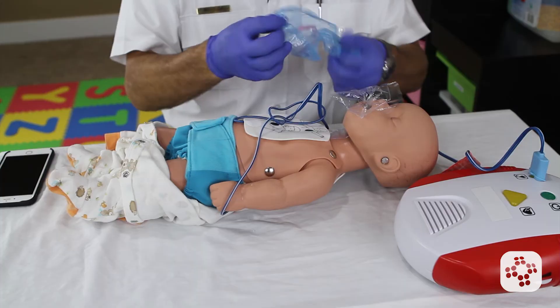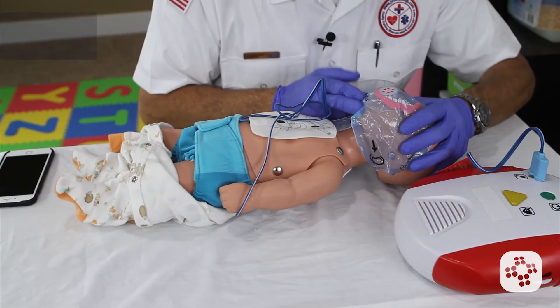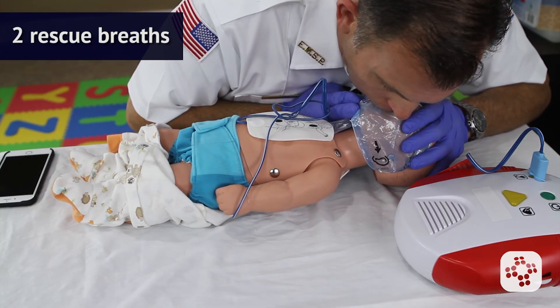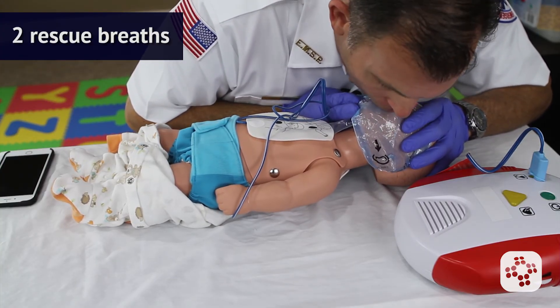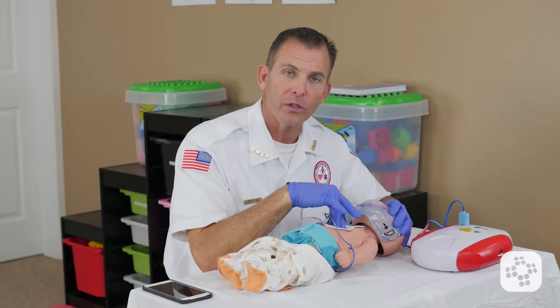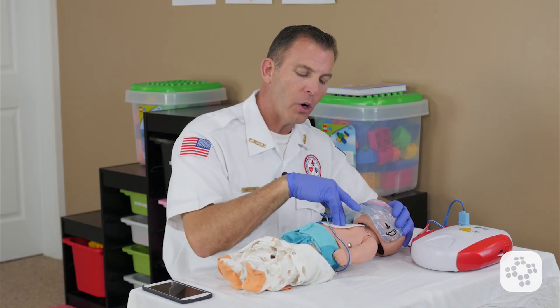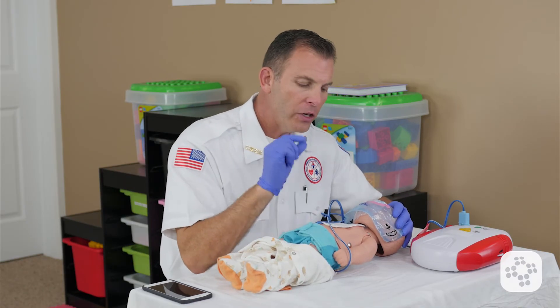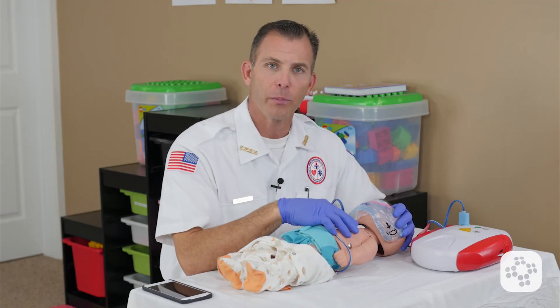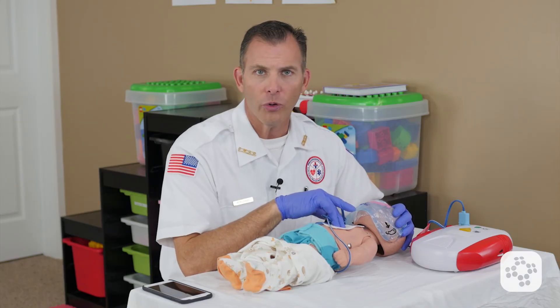We take our mask, put our one-way valve shield over the baby's mouth and nose, and deliver two rescue breaths. Then we go back into chest compressions for thirty more. Note that I'm pressing over the pad. At no point would we want to remove the pads from the back or chest of the baby. We leave everything intact and do CPR right over it.